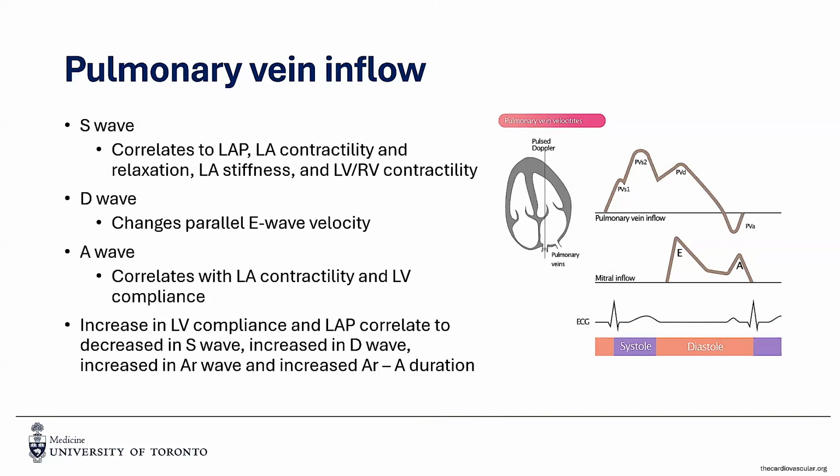This directly will impact the ability of your left atrium to relax after the contraction, and thereby decreasing the gradient between the pulmonary veins as well as the LA, and subsequently causing a smaller and smaller S1 wave. On a clinical exam, this would correspond to a more blunted X descent on physical examination. Oftentimes in very progressive disease, S1 essentially is entirely absent or completely disappears because of changes in atrial properties, or if you have atrial fibrillation that develops as a result of LA dysfunction.